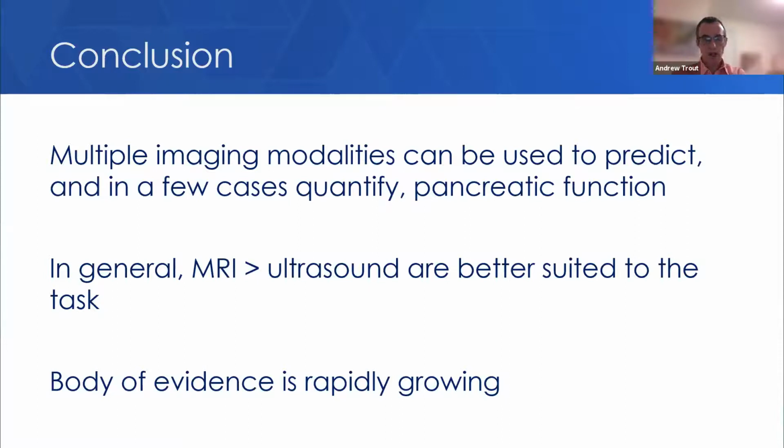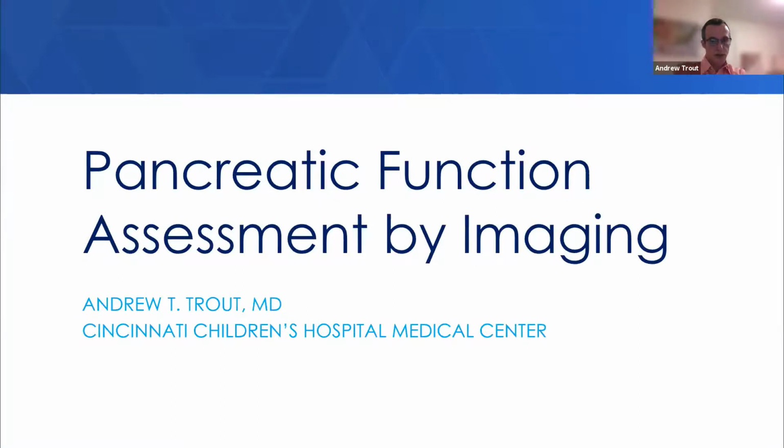The body of evidence for imaging to predict and truly measure both exocrine and endocrine function is rapidly growing and rapidly shifting. So I think there's a pretty bright future for collaboration in this space. So thanks for your attention, and I look forward to your questions.